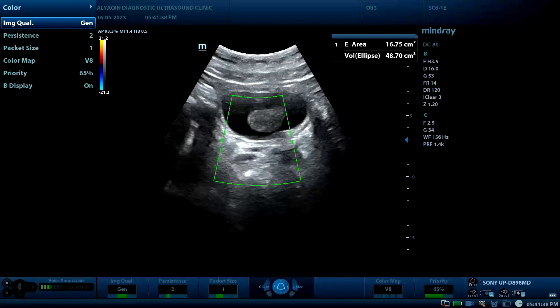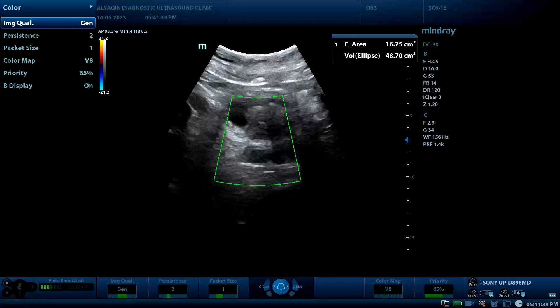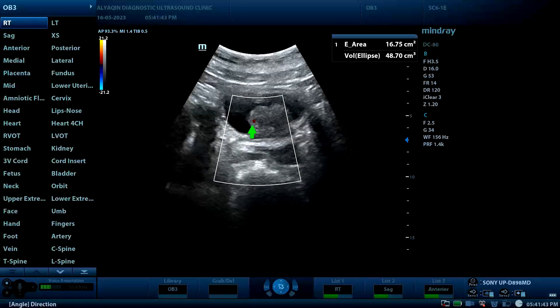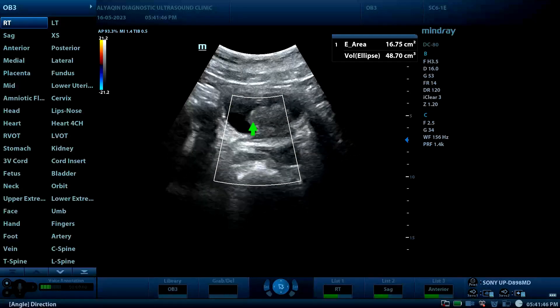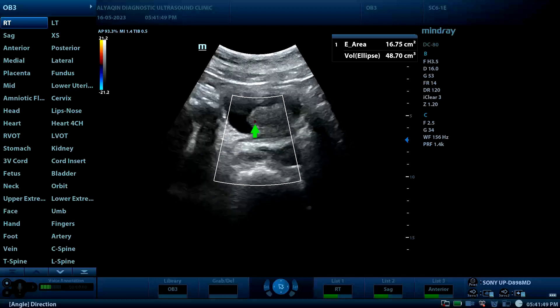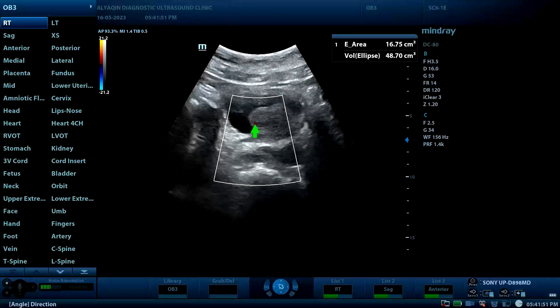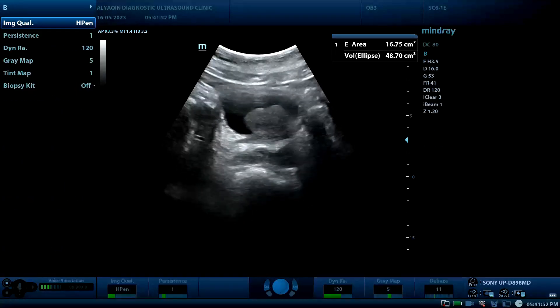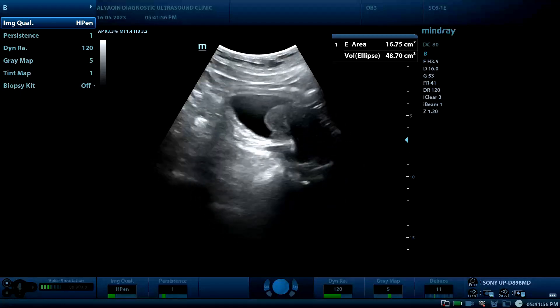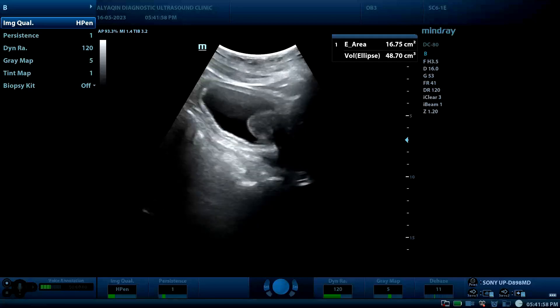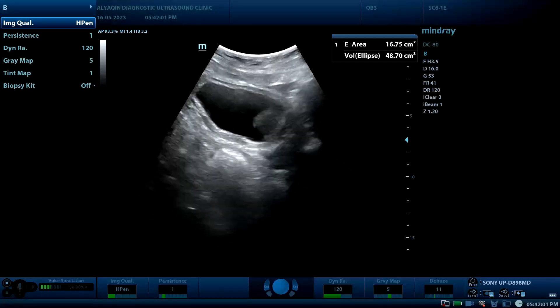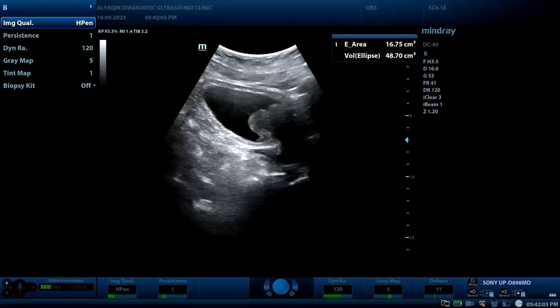On color Doppler, there is vascularity noted within the lesion. This is to exclude the possibility of blood clots — the vascularity confirms it is not a blood clot. The structure is also fixed in the same position during movement of the patient.